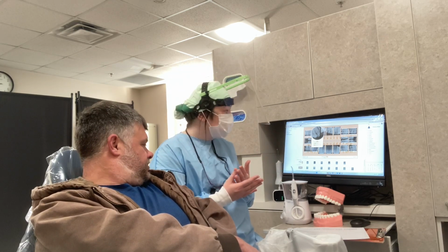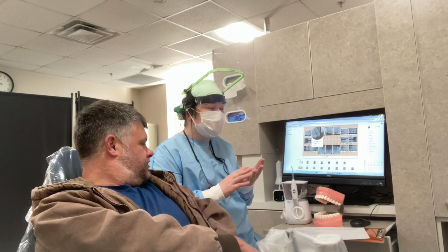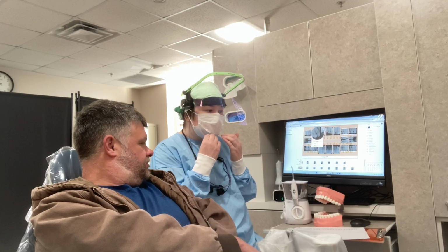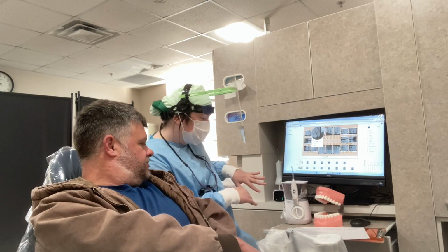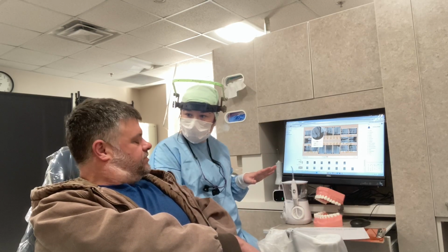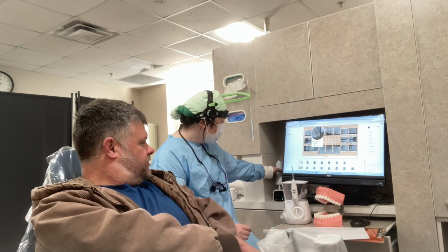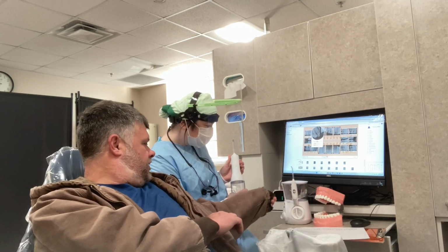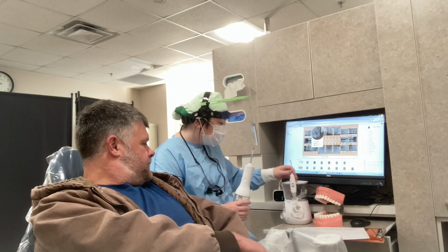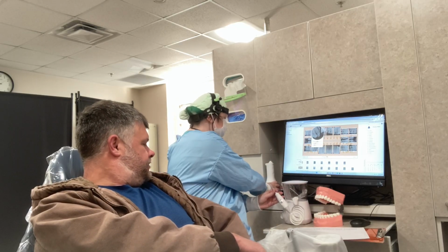So it's really great that you're taking care of your teeth, and that you really just focus at the gum line, how to take care of those teeth to help with that gum disease. And what I've pulled out are some aids that can help. You mentioned that you had a water flosser at home. Is it one of these, or is it like this? I think it's that brand. It's different than that. Okay. And so when you do this, do you mind just demonstrating?